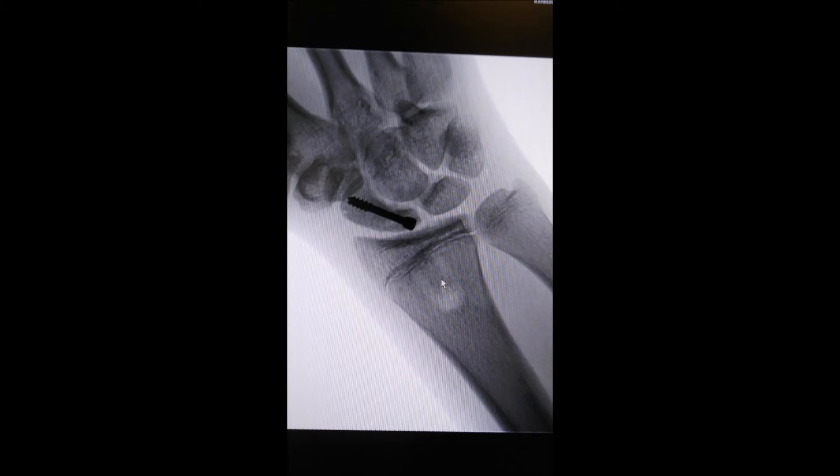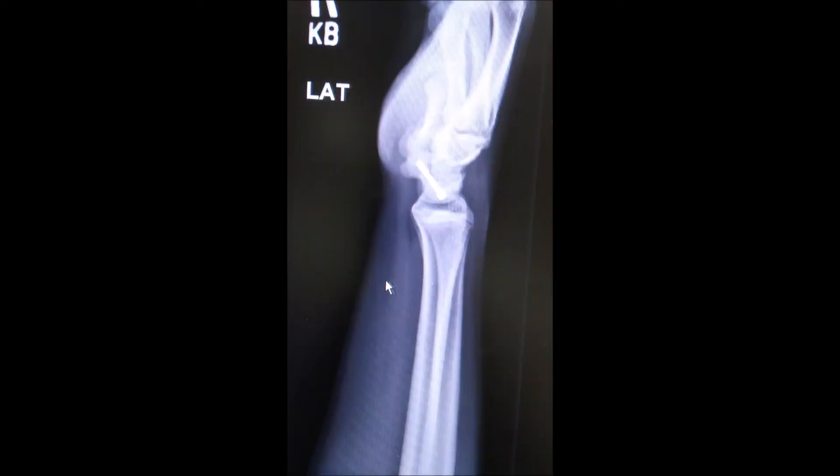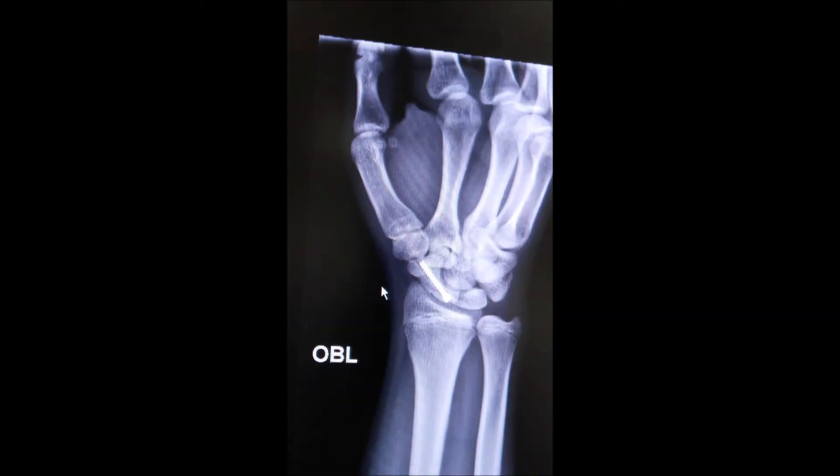It usually takes about 10 to 12 weeks for the fracture to unite, depending upon vascularity and other factors associated with the patient. This is something we saw at the end of about six weeks, where the fracture is beginning to unite. And this is the other view in which we can see the fracture is beginning to join together. And this is an x-ray taken at the end of three months, which shows complete fracture union.